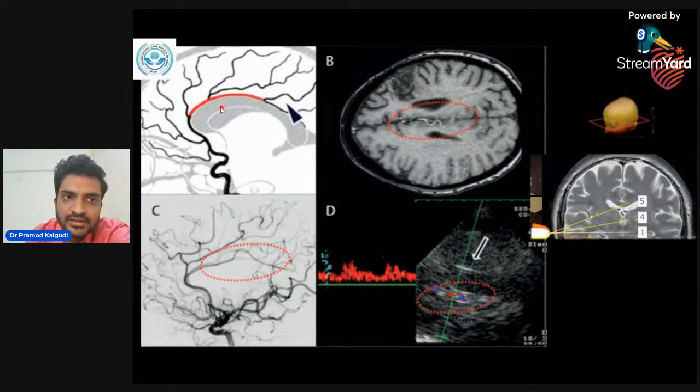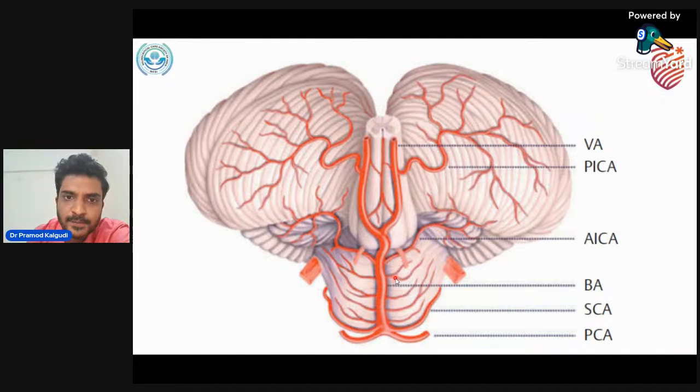And then the terminal branches of the ACA, same thing, you tilt from the mesencephalic plane, tilt it above. Again, you see the ventricles here. But remind you, this is medial to the ventricle. Last time we saw was lateral to the ventricles, you see the MCA branches. Whereas medial to the ventricle, you see the terminal ACA branches.